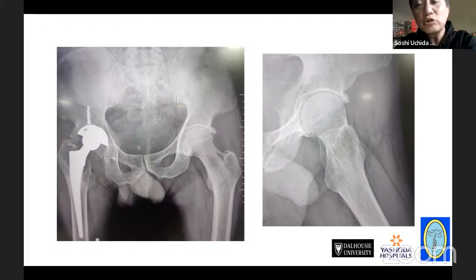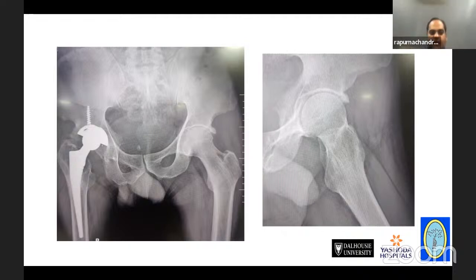Yeah, he does a peripheral first approach to get into the joint, and then the cam osteoplasty and the resection of the pincer, maybe labrum reconstruction, and then see how it works. That's what I'm thinking. Yeah, I totally agree. I am in sync with you, Professor.